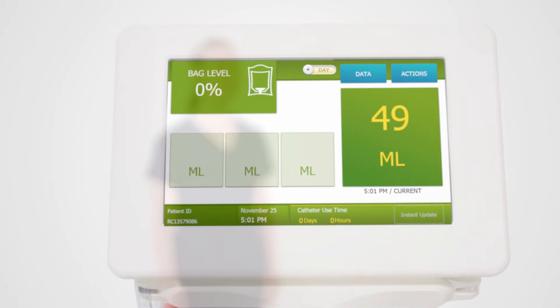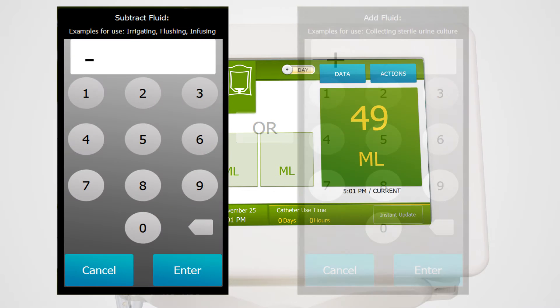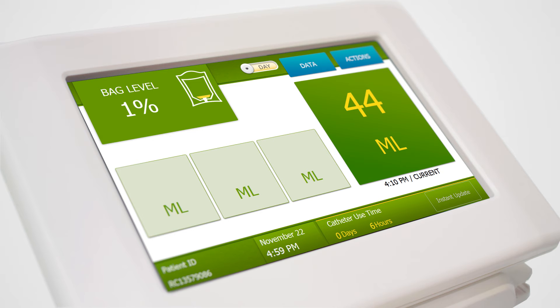Sensica UO contains a special feature called the add or subtract calculator. This allows you to subtract any fluid added to the bladder, for instance when taking an abdominal pressure. Likewise, the add calculator lets you add urine volume taken out before it reaches the collection bag, such as when a culture is taken. Since Sensica UO will automatically change the number recorded, you don't need to make manual adjustments or notes for the electronic record.